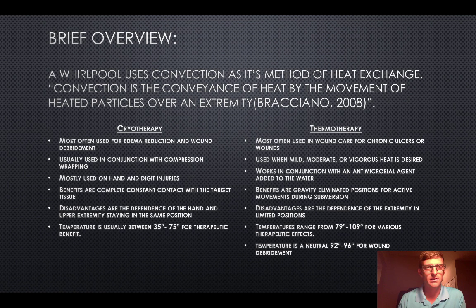Its method of heat exchange is convection, which from our book states that it's conveyance of heat by the movement of heated particles over an extremity. There's two different ways to use Whirlpool therapy, so there'd be cryotherapy or thermotherapy. We have it labeled in class and in the book as superficial heat for thermotherapy, but it also states it in the book as thermotherapy as well.